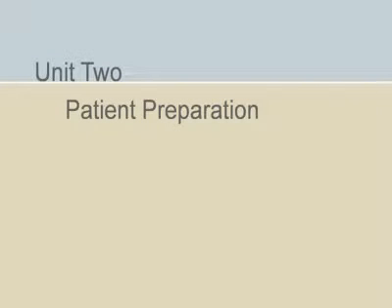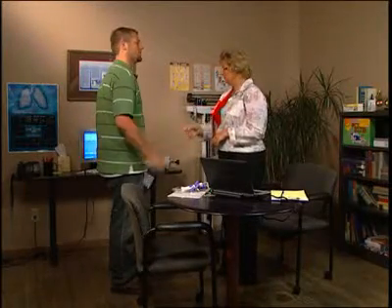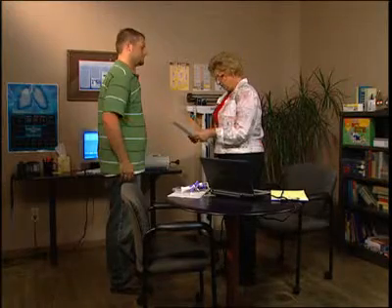Having completed equipment preparation and calibration, it is time to meet your patient and prepare him or her for the spirometry testing. Introduce yourself as the patient enters the room. This will help put the patient at ease. Verify the patient's identity per your institution's procedural code.